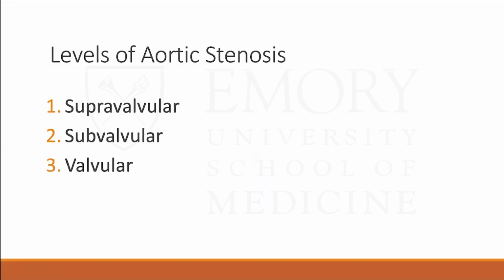One thing to keep in mind is that aortic stenosis, we typically think of as valvular, but the stenosis could either be above the aortic valve or below the aortic valve.